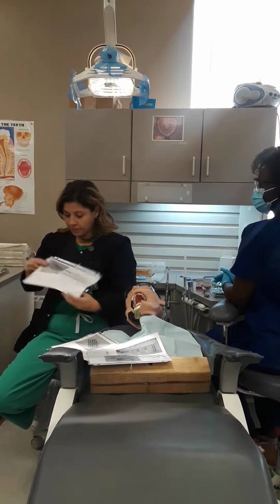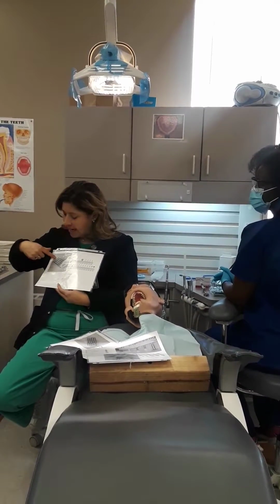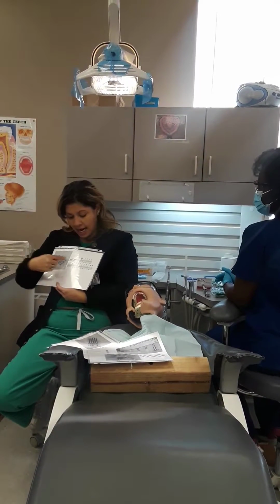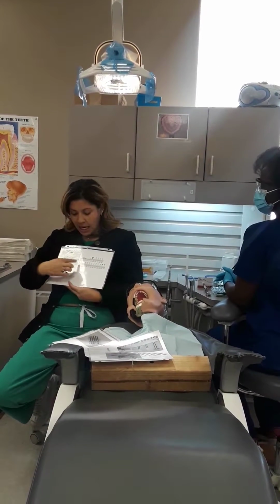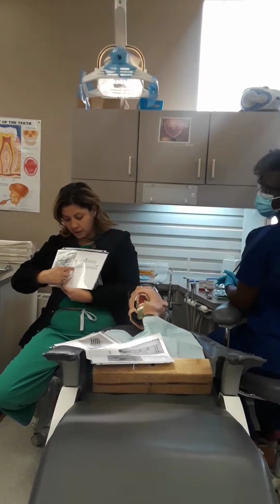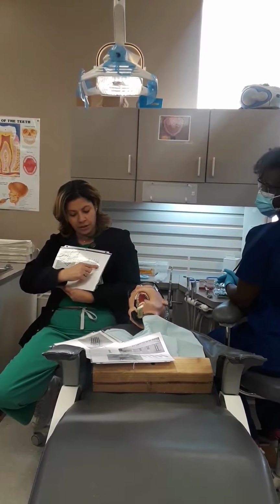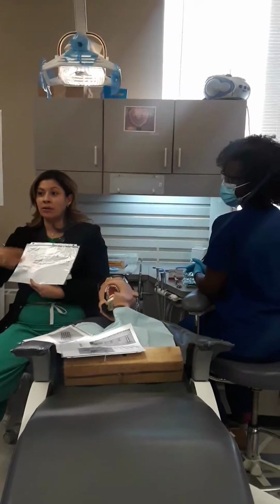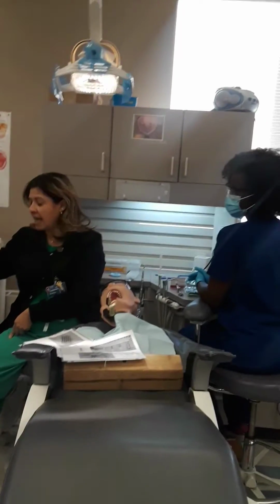Flip it over. This burr is actually our slow speed burr. It has a different type of end because it gets locked into the device. They have different sizes of rounds, so that's why I printed that. When they say size 2, we're just going to look for a size 2 burr, according to the roundness. The bigger the number, the bigger the round. So these are our carbide cutting burrs for removal of decay.